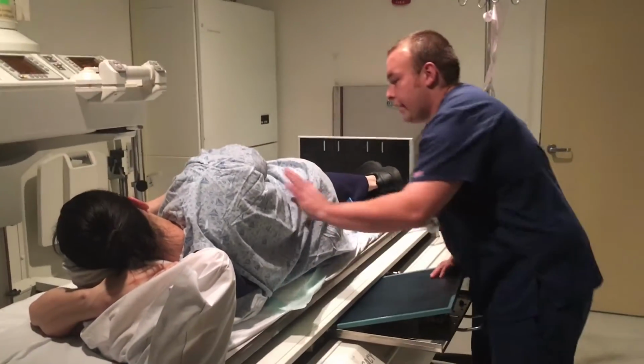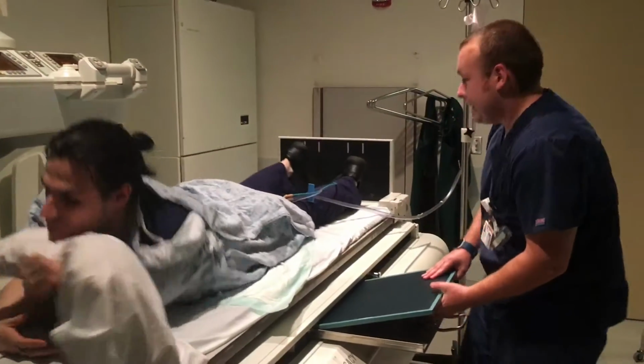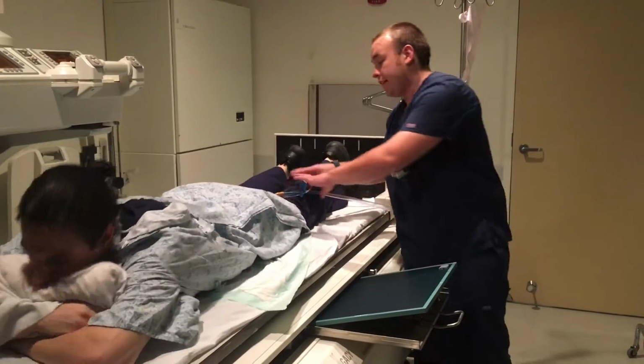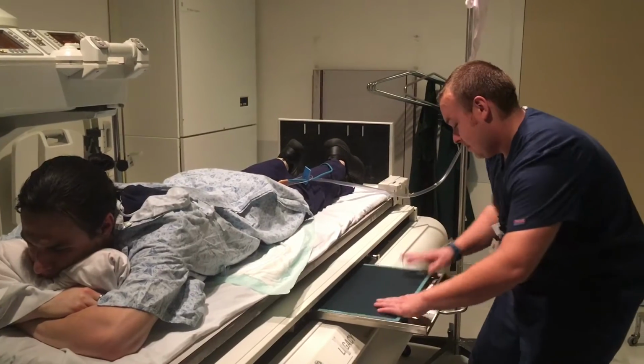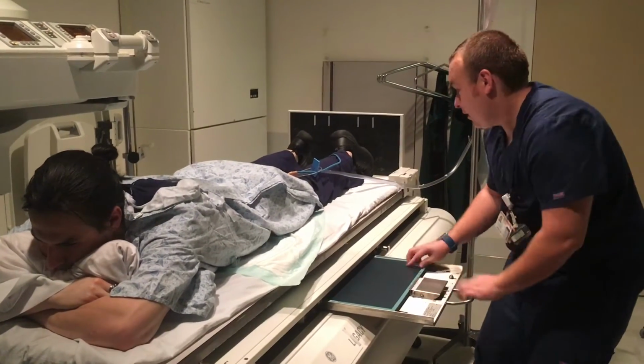Alright. Go ahead and lay on your belly, sir. Anytime the patient moves, you want to make sure that the tip stays in. Otherwise, you're going to have a mess. The patient ain't going to be too happy.